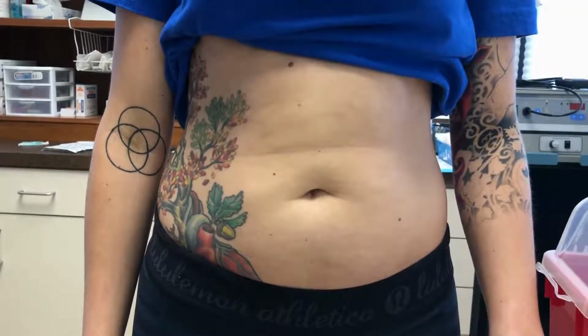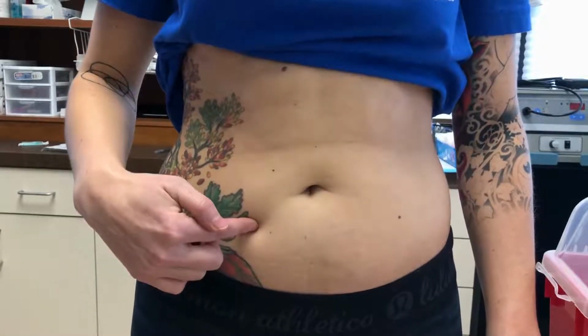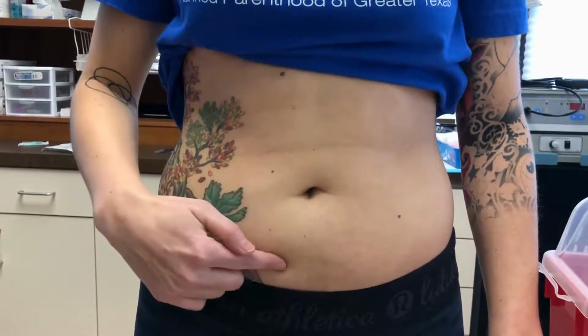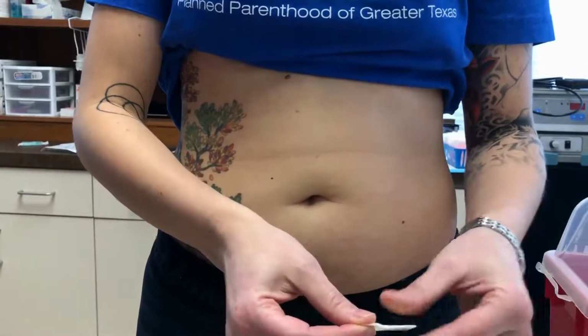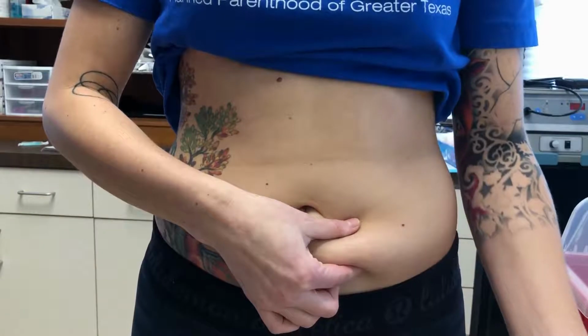For performing subcutaneous injections of the abdomen, be sure to inject at least 1 inch away from the belly button and do not inject above the belly button. Make sure you rotate sides each week. So with your alcohol pad, pinch the skin, wipe in a circular motion away from the injection site and allow to air dry.